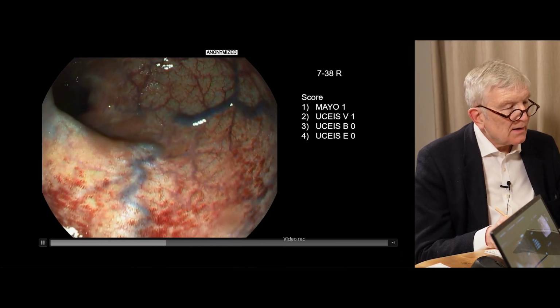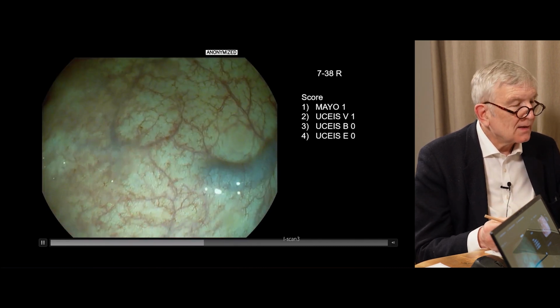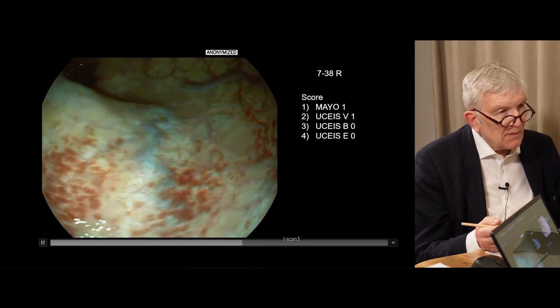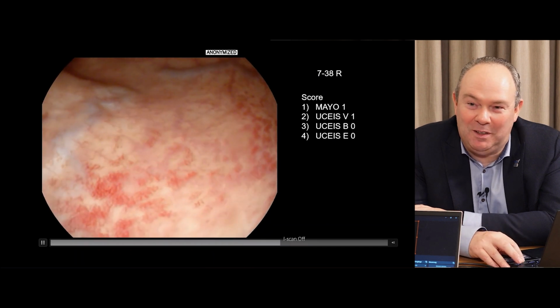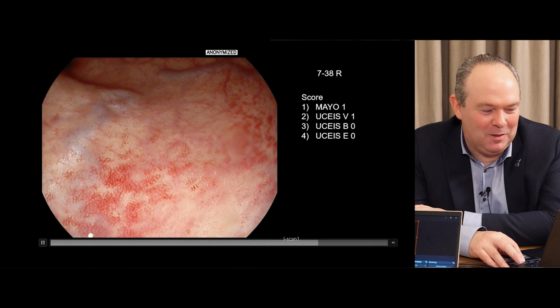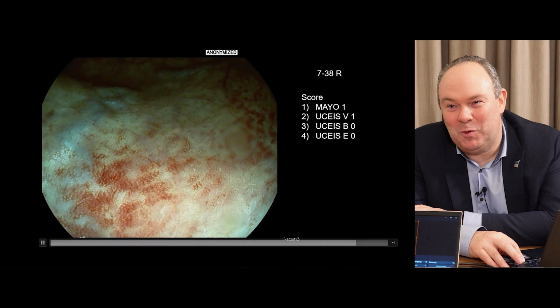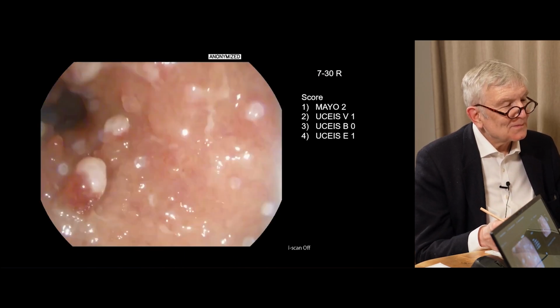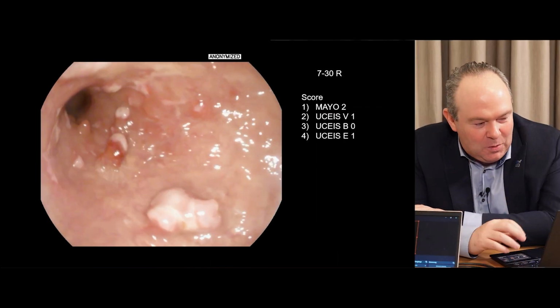Because if this is an ulcerative colitis patient, then he is under therapy. It's a different thing. But if the biopsy comes back with mild inflammation, and the patient is asymptomatic, I would not start therapy. This could also be a prolapse, this finding, at this lower end. Here we know the patient had ulcerative colitis, so then we can use the score. I would not immediately use a Mayo score if I'm not sure the patient has ulcerative colitis. Then he has the label forever. Exactly.